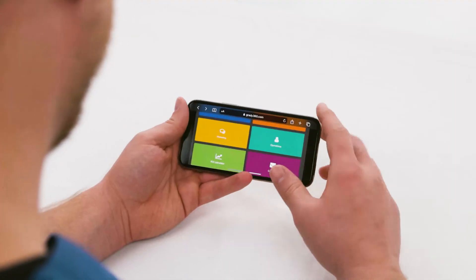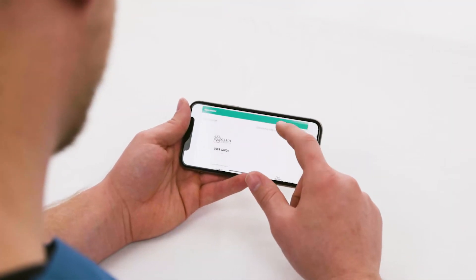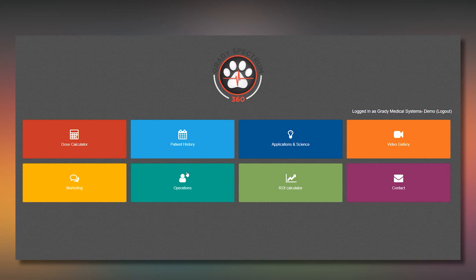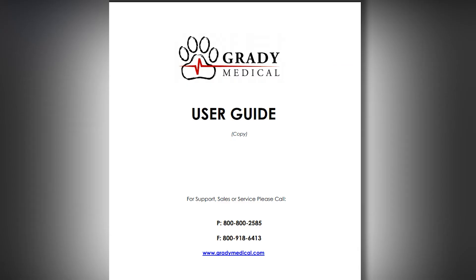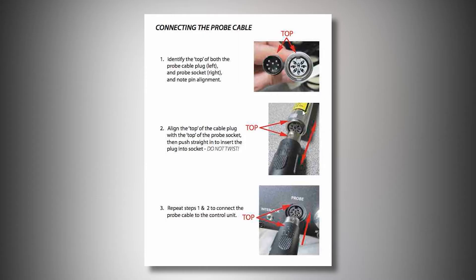After you've logged in, head over to the Operations tab. Here you'll see a user guide, operating manual, and a printable dosage chart. Dive into all of Grady's exclusive digital resources ready and available to you.